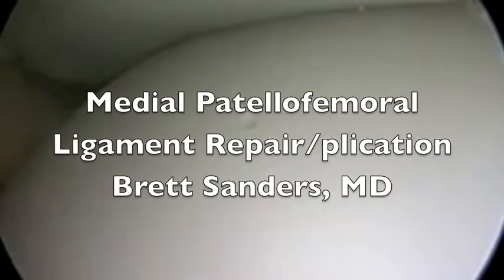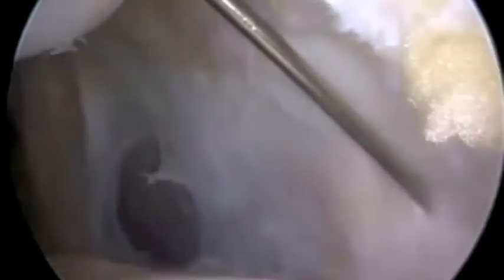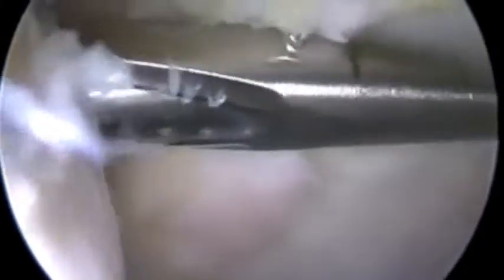This is a good example of how soft tissue balancing can affect the patella intraoperatively. This patient had a patella dislocation with rupture of the ligament, and here's the patella subluxed off the side of the femur there, statically. We're freshening up the origin of the medial patellofemoral ligament in anticipation of repair.